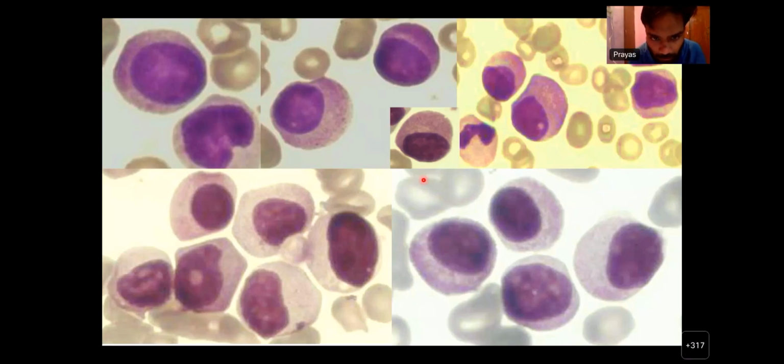So as compared to some of the older typical cases that we saw, what do you think of these granules? Are they prominent, or are these granules very faint? Faint. So these are very inconspicuous, finely granulated cells, all right? And their nuclei are regular. There is no folding in these nuclei at all, but they do appear to have some prominent nucleoli in them that you can see.